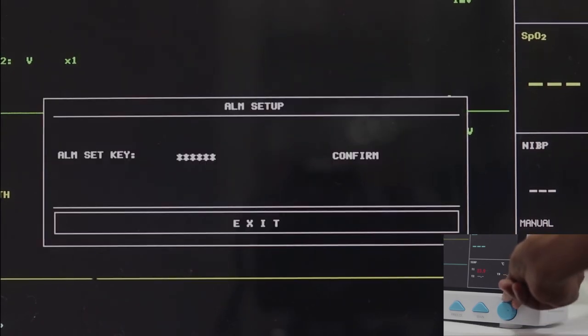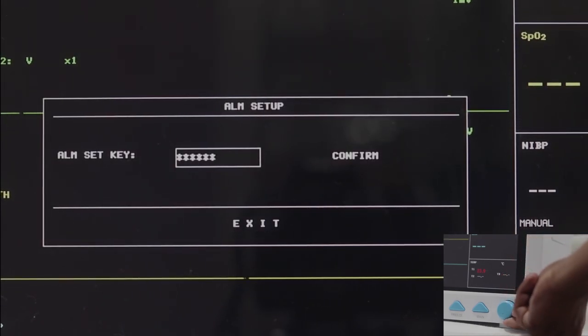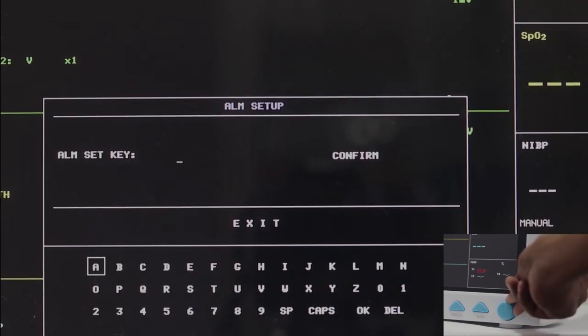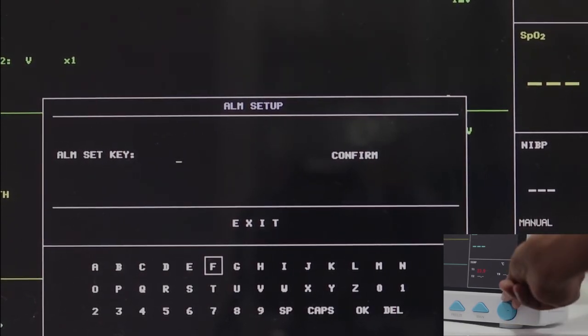Alarm Setup: You have to enter a password every time you want to set up an alarm. The password is 70808.